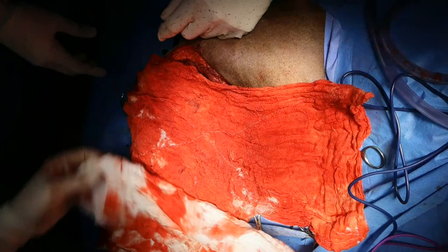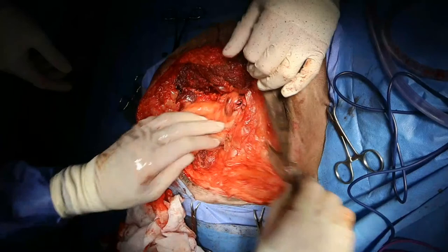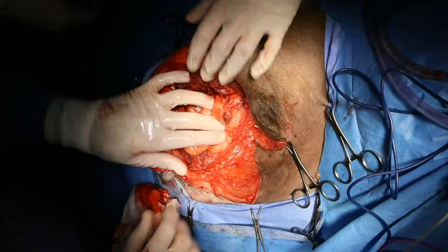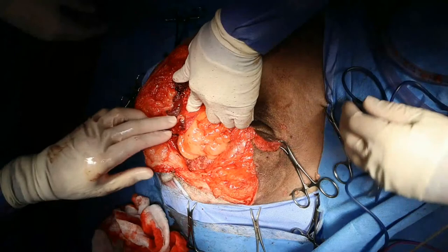So. Yeah. All right. So now we've got a hernia here. So we've got this abdominal, the prepubic tendon right here. And basically, that's going straight into the abdomen. So we have to figure out what we're going to do to close that. And I haven't decided whether I'm going to do a polypropylene mesh. So that's colon right there. Feel that? You can feel stool in the colon.